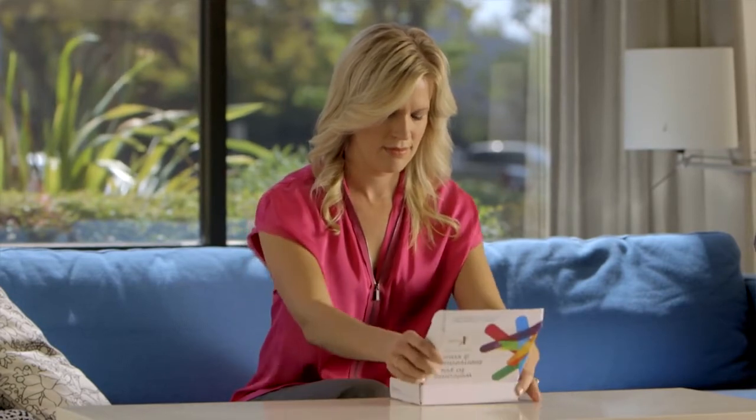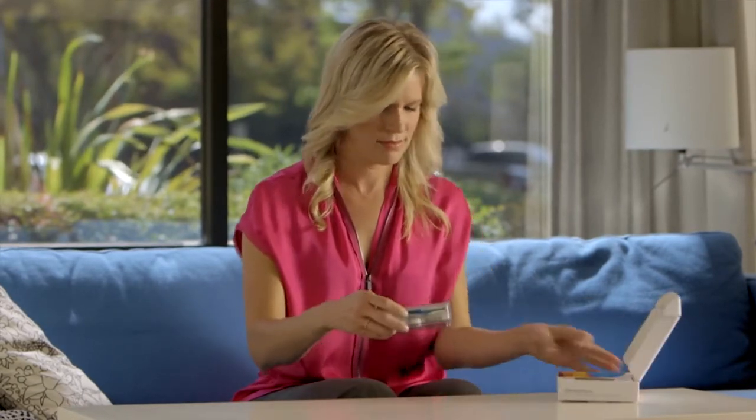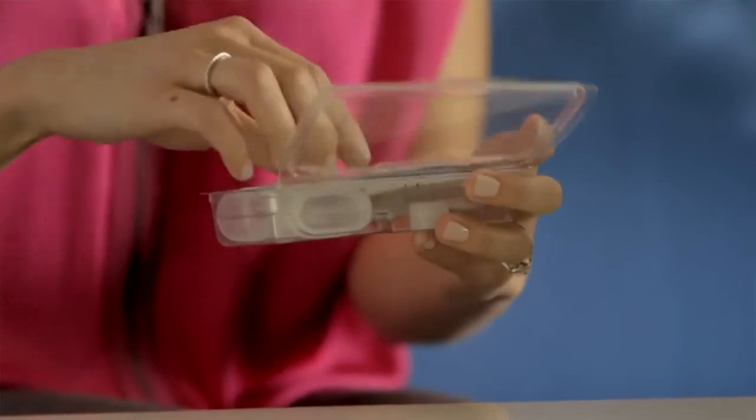After you register, it's time to provide your saliva sample. Here are a few tips to make sure that your sample is viable.